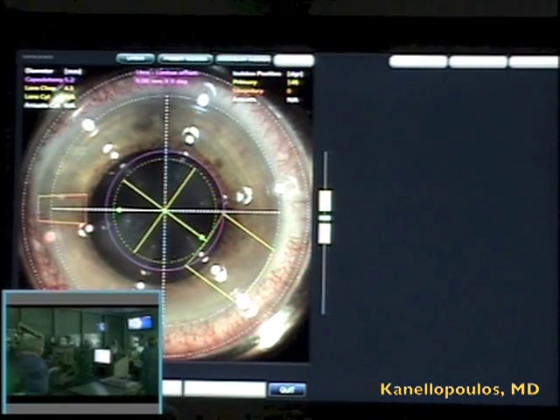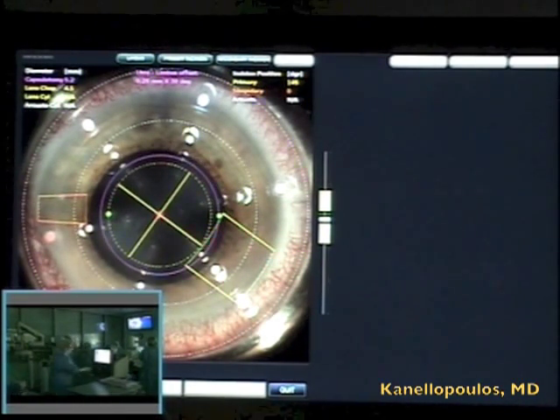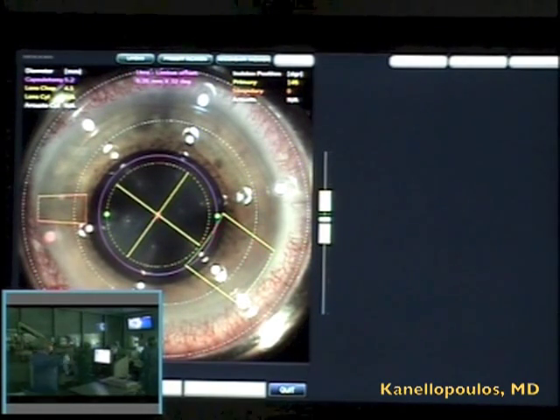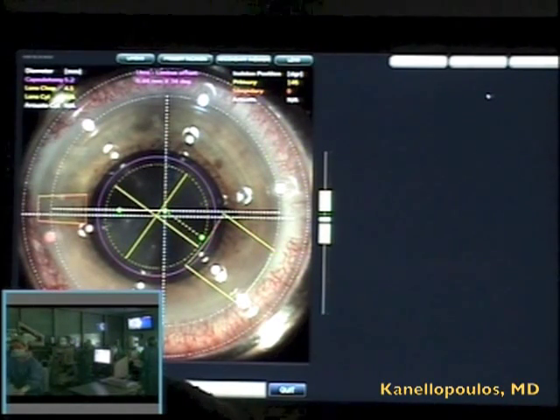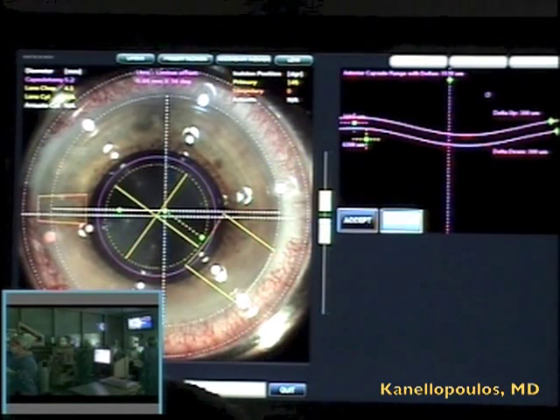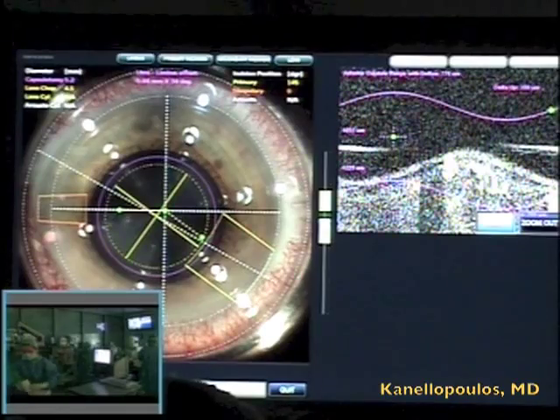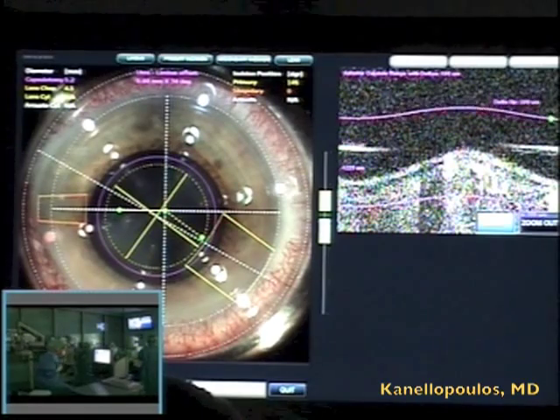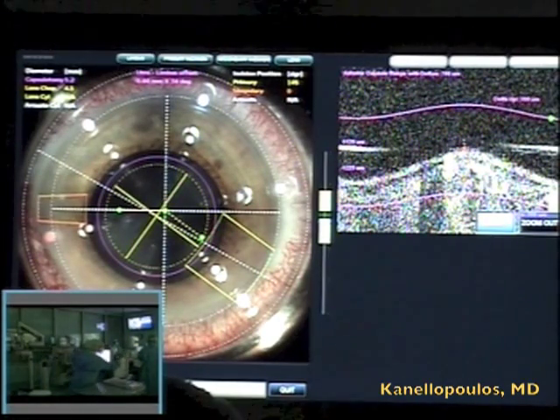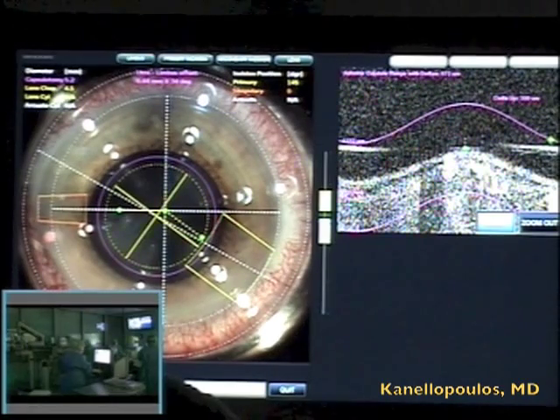You can see here fine-tuning the main incision and the paracentesis. We're going to now center the complex of the lens fragmentation and capsulorrhexis. The capsulorrhexis is the purple circle, outer circle. The yellow lines is the lens fragmentation — this is our own technique devised to perform the lens fragmentation all the way up to the surface right under the anterior capsule. I'm adjusting here the capsulorrhexis; this is one of the rare occasions where the computer did not sense a correct depth and thickness capsulorrhexis with the soft fit software and application.